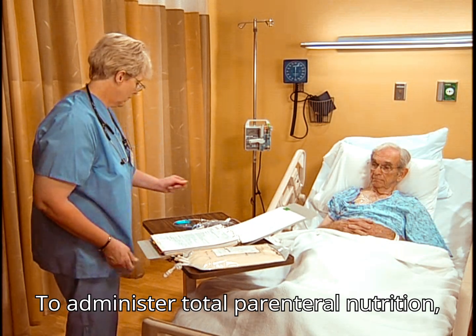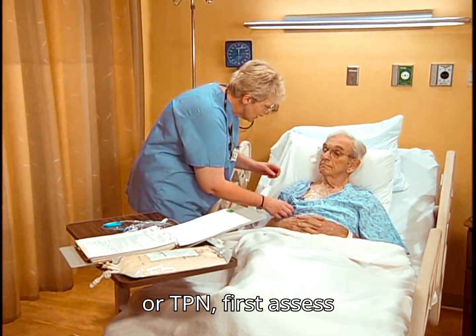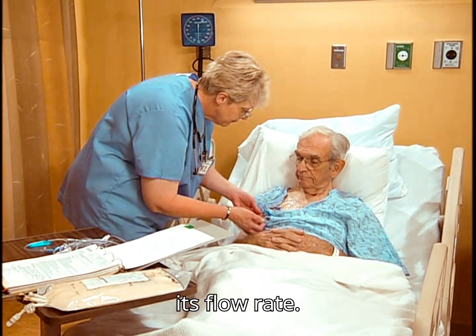To administer total parenteral nutrition, or TPN, first assess the patient and check the physician's orders for the type of TPN solution and its flow rate.